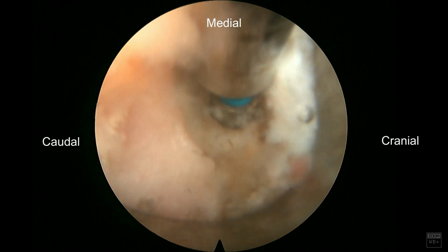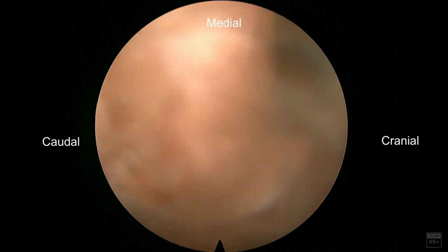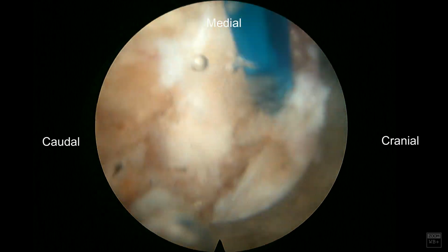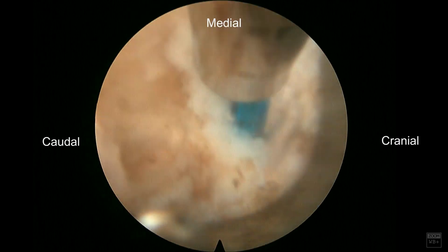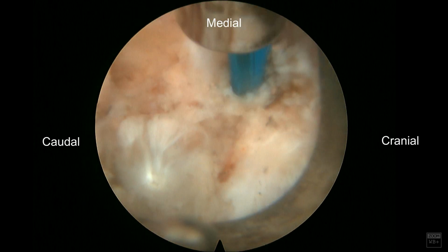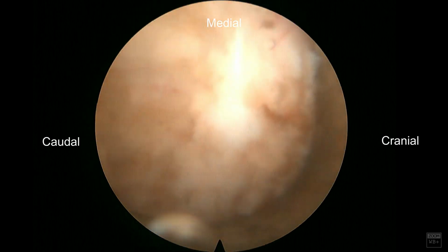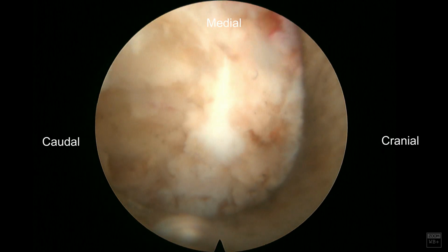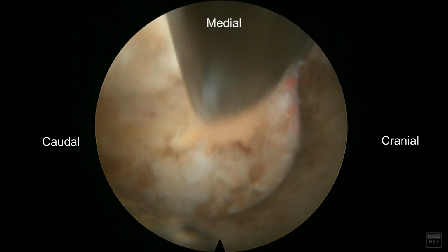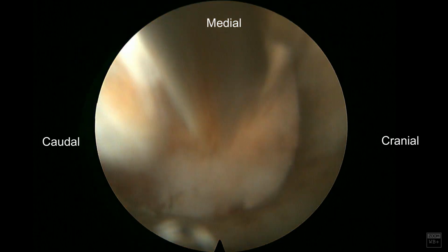And so I know here that I'm already at the joint here, and I went into this area because I know that I have to decompress the lateral recess and take part of the facet joint laterally. So I'm clearing this out, trying to get a feel for how far I want to extend my decompression laterally. Of course, you don't want to destabilize that segment, and so I always make sure that I use the diamond burr to measure how far I'm decompressing laterally.